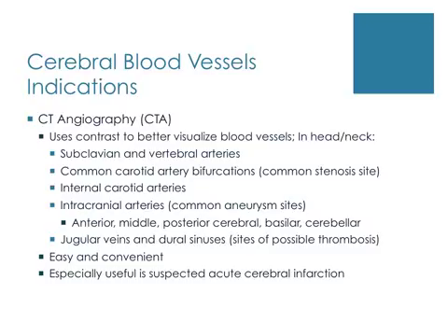An important use for a CT exam is in suspected acute cerebral infarction because fast intervention may result in a significant lessening of the extent of the brain damage. So if the exam is done quickly and the results are sent to the ordering doctor quickly, then intervention can occur and less brain damage will occur as well.